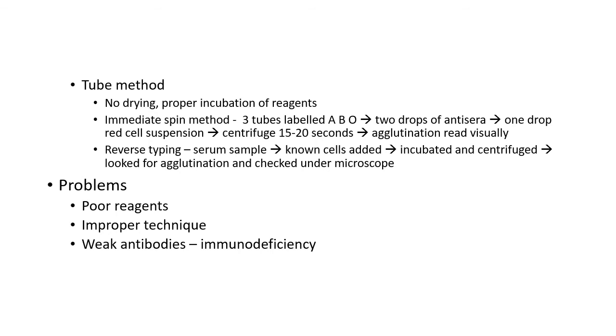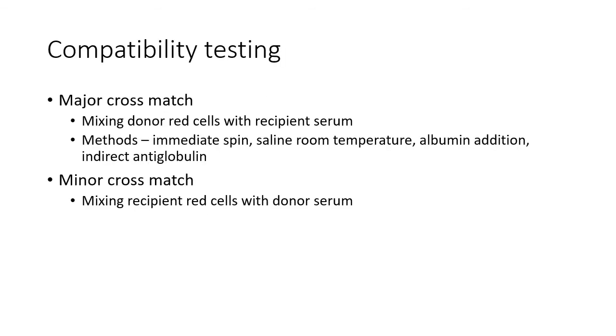For example, in immunosuppressed patients, there might not be enough antibodies to elicit agglutination. Coming to compatibility testing, this refers to a set of procedures required before the blood is issued from the blood bank as being compatible for transfusion.